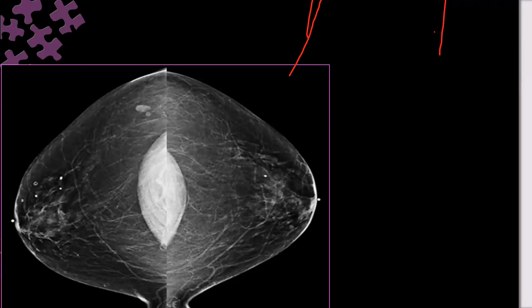Adequate. The pectoralis should not appear; any different opinion? Do you all agree with that? It is optimal. There is a little more lateral portion than medial, maybe because the nipple is centered. You have to accept minimal, you see, but not much.